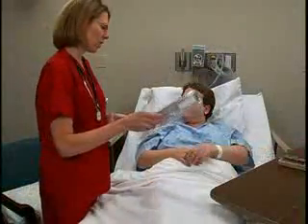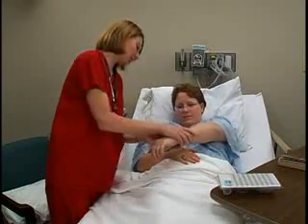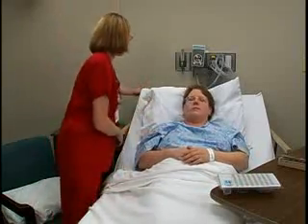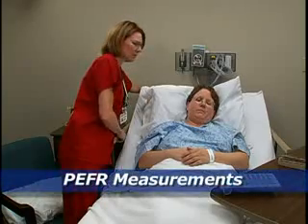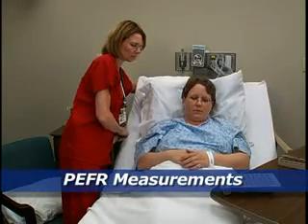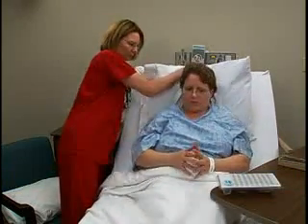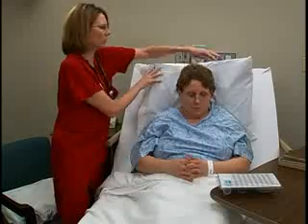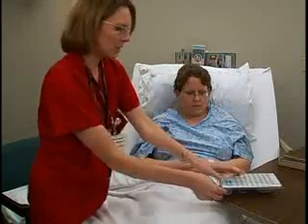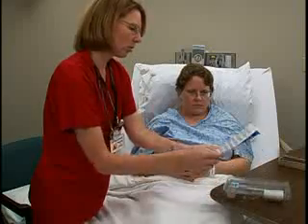We're going to check your peak flow with the peak flow meter. Okay. Let me check your arm band. Sure. To assess the effectiveness of any airway management technique, measure the patient's peak expiratory flow rate, or PEFR. Once you've explained the purpose of the measurements, help the patient into a high Fowler's position. That's good. Good? Okay. This is a peak flow meter. We're going to check to see how your lungs are doing.